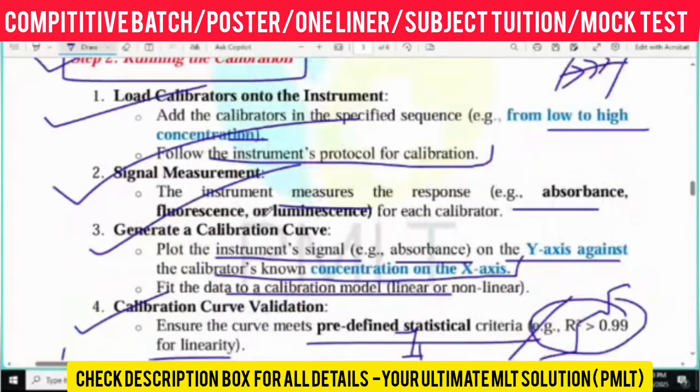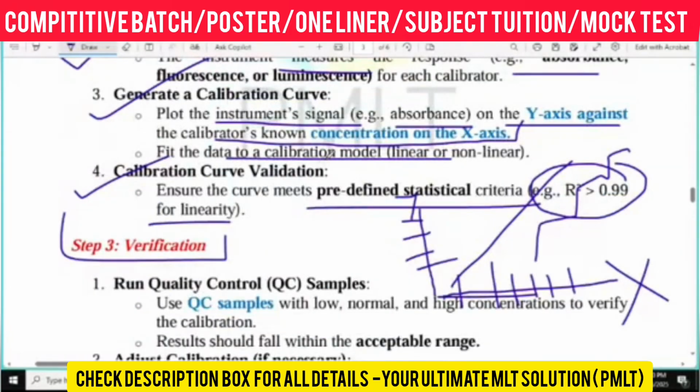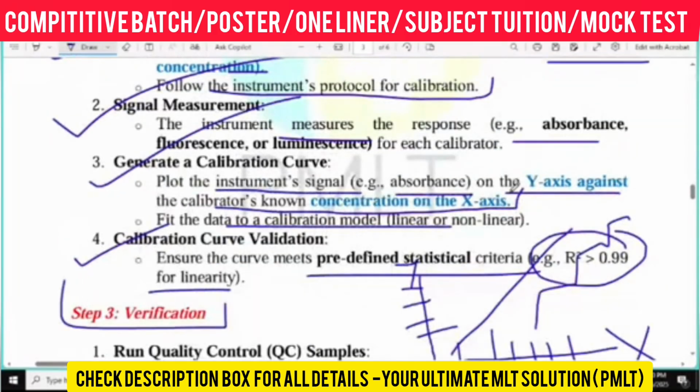So if I sum up these things: first you load the calibrator, then you measure the signal of this particular calibrator, then you generate the graph, then you compare the graph with this particular normal concentration. Getting my point?